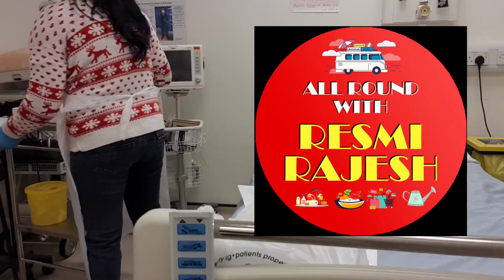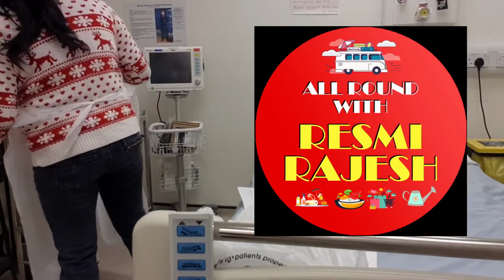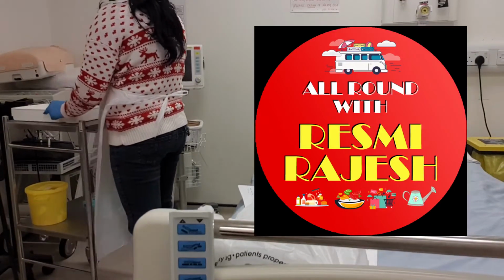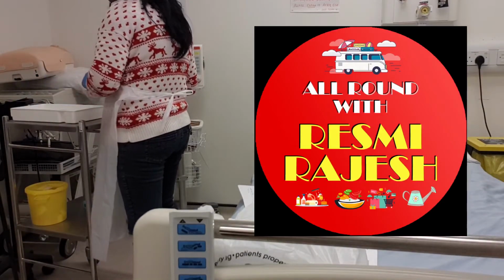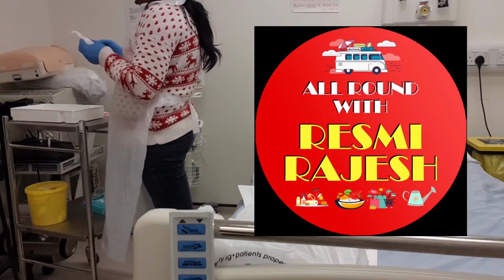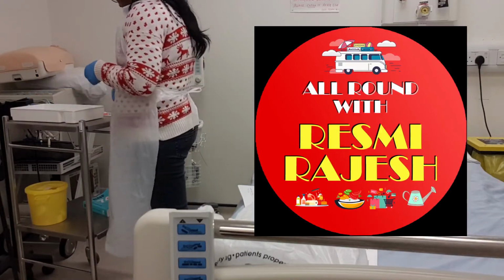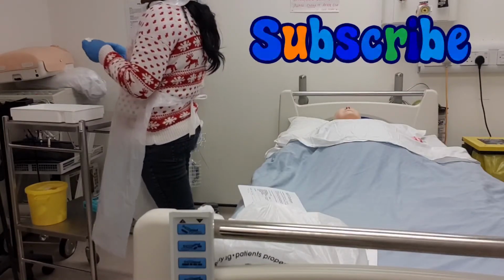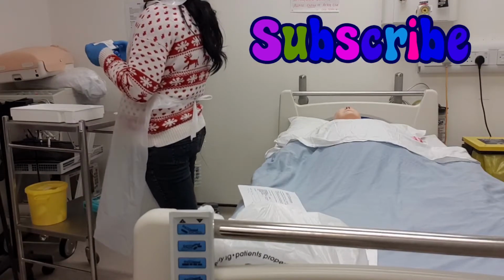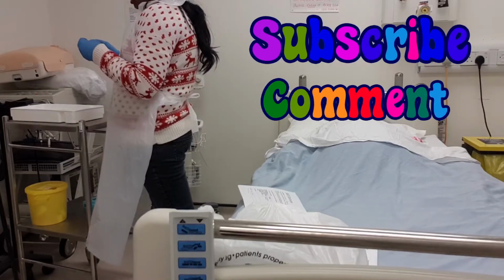So I have to prepare my articles ready. The tray is clean and tidy within 24 hours, so I don't need to clean that. So I need a gauze. This is dry and undamaged, and the expiry date is 12/2025. And I need an insulin syringe. This is dry and undamaged, and expiry date is 31/1/2026. I have got my injection, sodium chloride 10 ml.